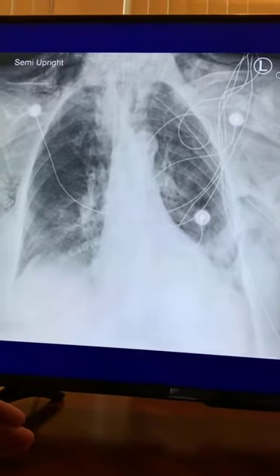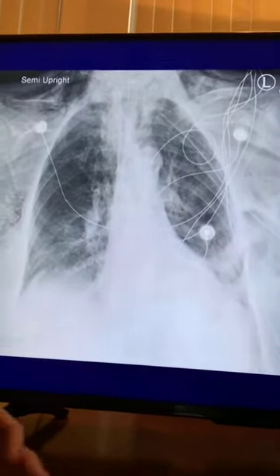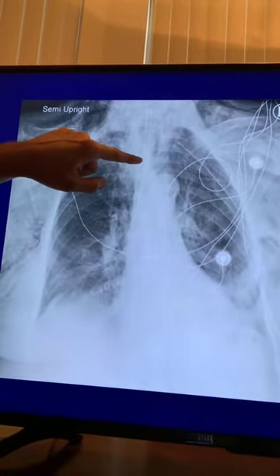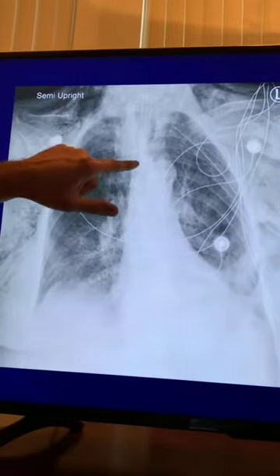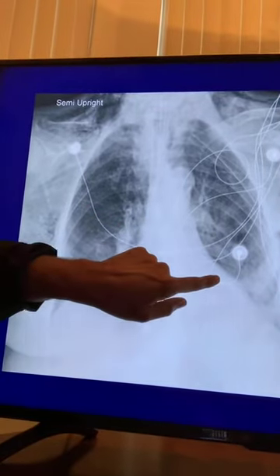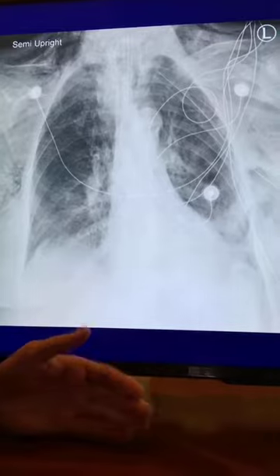That's sub-Q emphysema. So that's what you actually want to be looking for when you see sub-Q gas. There's different reasons for it, different causes for it. It can happen with trauma. It can happen with a lot of things. But that's what sub-Q gas looks like. And then you want to start looking at the mediastinum, and look for those lucent areas in the mediastinum as well. If you do have lucent areas in the mediastinum that shouldn't be there, then you need to start thinking about pneumomediastinum. This guy doesn't have it, but if you ever saw a lucent area outlining the heart itself, then you want to be concerned about a pneumopericardium.